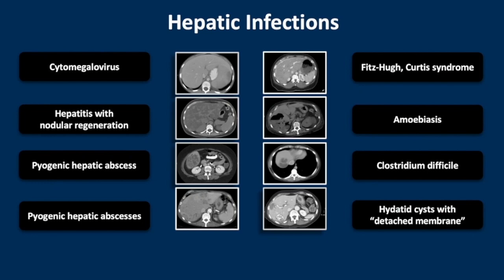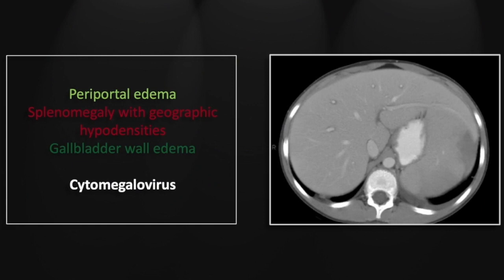Our topic for this session will be hepatic infections. Our first case is cytomegalovirus infection in a child. This is a great example of periportal edema — you see the circumferential hypodensity surrounding the portal venous branches. There is marked splenomegaly, and as is frequently the case, the spleen becomes friable and outgrows its own blood supply, resulting in multifocal infarcts, one of which you see here.